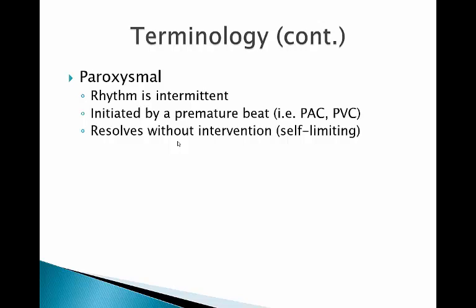This can actually be pretty dangerous because if that happens, then clotting can form and the patient doesn't know it because they're not in it long enough to really have a problem. Or they go to the doctor because they're not feeling quite right, but the EKG looks normal at that time. Sometimes this is when the patient may wear a Holter monitor, which is a cardiac monitor that they'll keep on 24 hours a day for a day or two, sometimes 3, to try to catch these things that are happening to give the cardiologist a picture of what's going on.